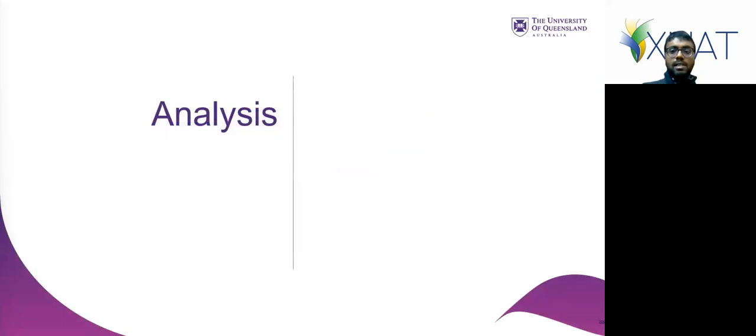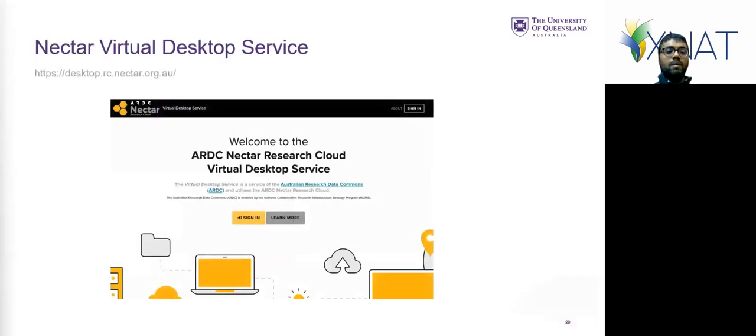Okay, so this is a slight side note. This is about analysis. Especially across HERF, we have a variety of users and they have access to various different infrastructures. So we won't talk too much about the different infrastructures. Basically, you can pull your data in using the browser, XNAT utils, and all the various clients and services. But any user of our service will have access to the Nectar virtual desktop service. So we recommend looking at that if you're not sure about analysis. I won't go into too much detail, but basically it's a service provided by ARDC.